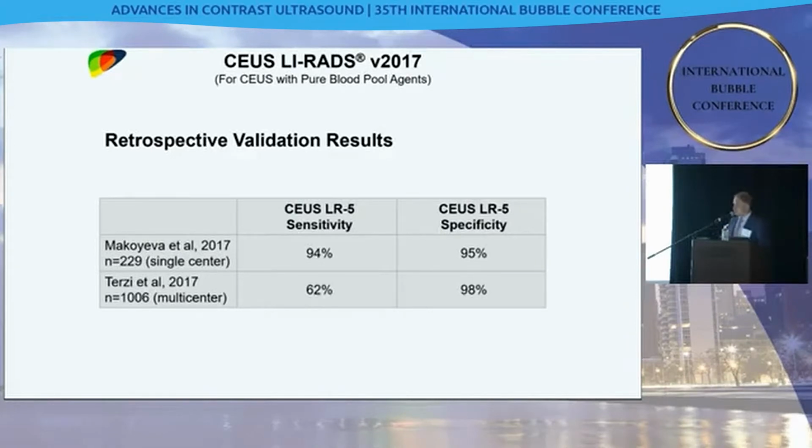And I think one of the most important achievements of the LI-RADS group was designing a very standard and very rigid protocol of image acquisition with arterial phase enhancement, cine loops, and then intermittent imaging for up to 7 to 10 minutes. By doing that, we can now look at data between different hospitals and between different institutions. So with that, it was very, very promising.